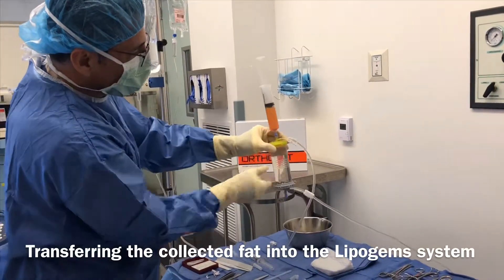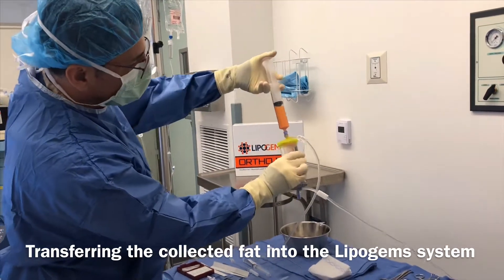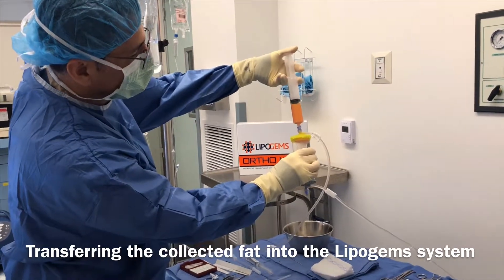We're now transferring the harvested fat into the canister — it's a LipoGems canister. It's going to start the filtration system right here.